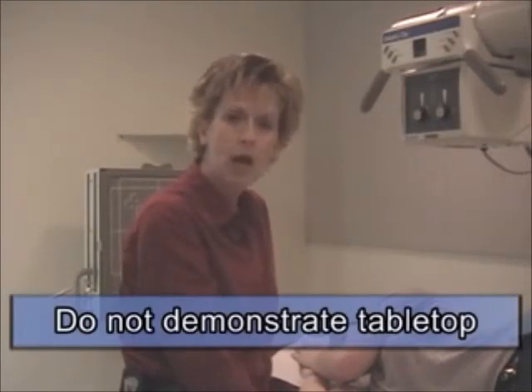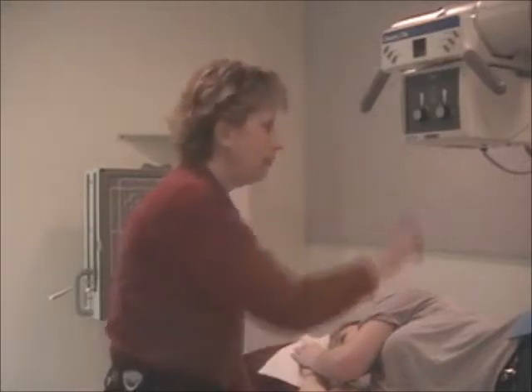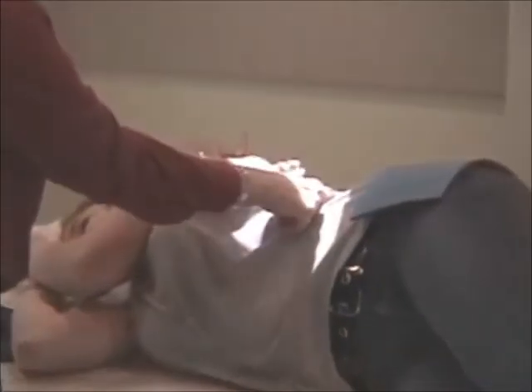So one of the things that we just experienced now is your instructors or you as a tech are going to give you certain reference points. I'll recap that one in a minute. But if you ever X-ray tabletop, the rule is that's not valuable information. Alter your positioning. Do not demonstrate tabletop. Give the physicians the body to look at. Give them some GI to look at. Right lateral, tip of the scapula, iliac crest. Divide that halfway and go down 1 inch for sthenic body habitus.